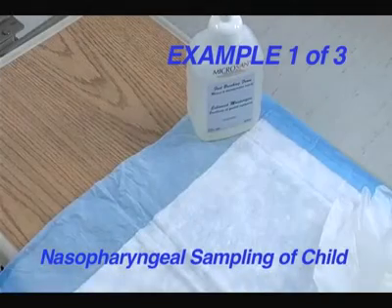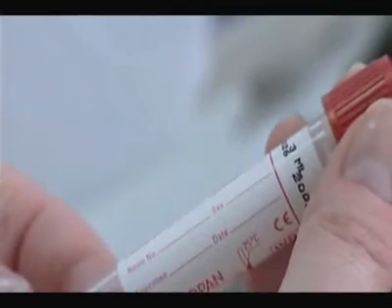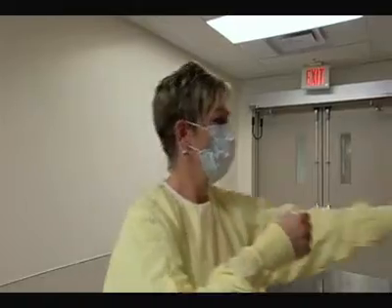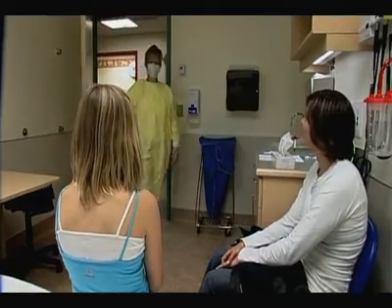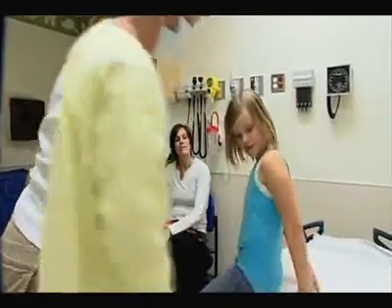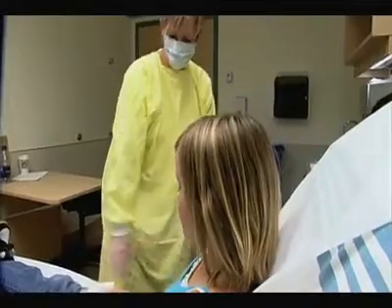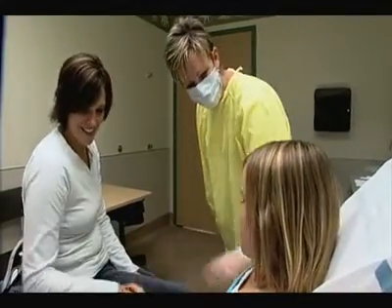Prior to collecting the nasopharyngeal swab, assemble the appropriate supplies such as a pen, requisition, and viral transport medium. Check the expiry date of the transport medium on the container to ensure that it's still in date. Follow the appropriate infection prevention policy of your institution, which may require a mask and gloves. Explain the collection procedure to the child and parent, and make the patient comfortable. Mom can hold her hand if needed.